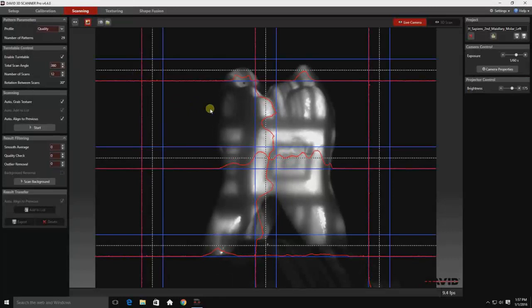Now let's move over to scanning. Here you can see I'm showing you the brightness control and how it can affect the exposure lines, which are the red lines.